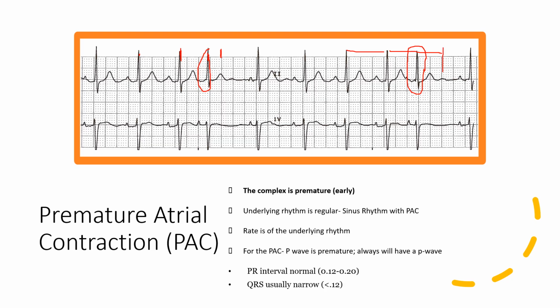So when we count the heart rate, we're going to count it in the space it should have occurred. Similarly with this complex that occurs early, if it were the same distance apart as these, then it actually would occur right about here. Why is this important? Because some of these, if we stretched them out at the same distance, may put that complex off the end of the strip. If it moves that complex off the end of the strip, we don't count it.